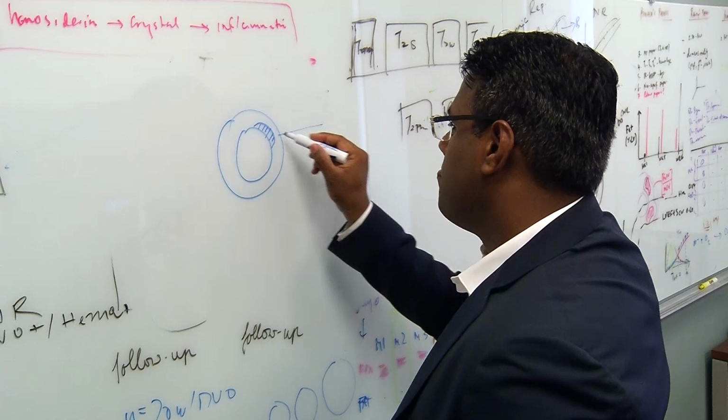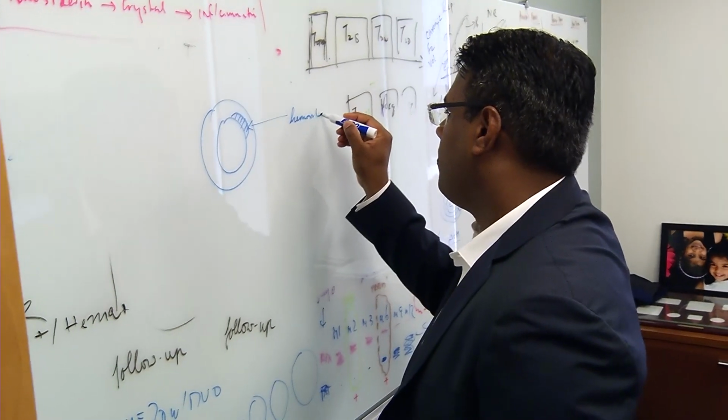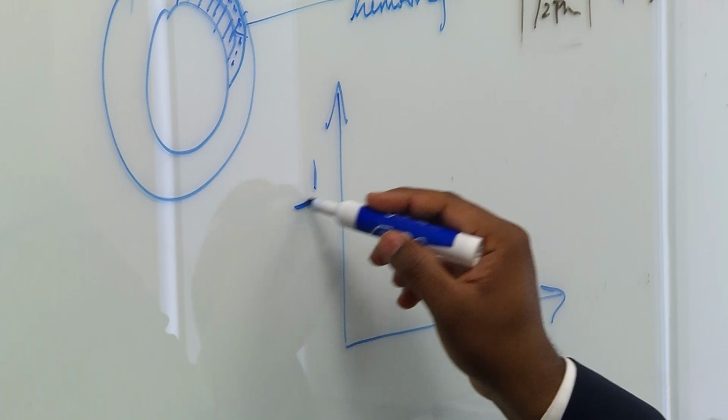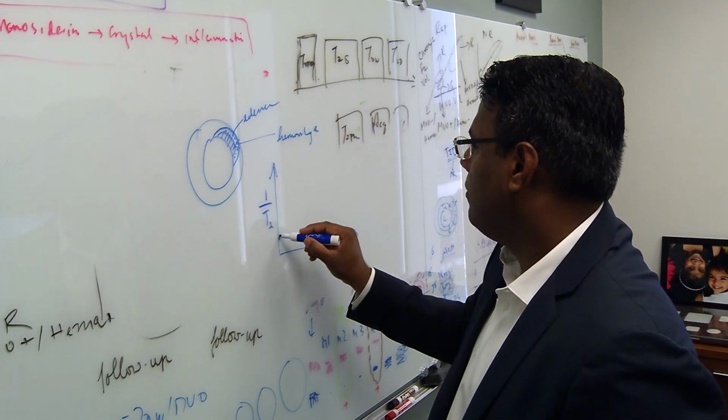The future of cardiac MRI, I think, would greatly benefit from the use of non-contrast imaging methods because, one, first of all, it opens the door for imaging pretty much everybody. Second, you don't have the cost associated with contrast agents. Also, it makes exams faster. You can do serial exams, and it becomes cost effective.